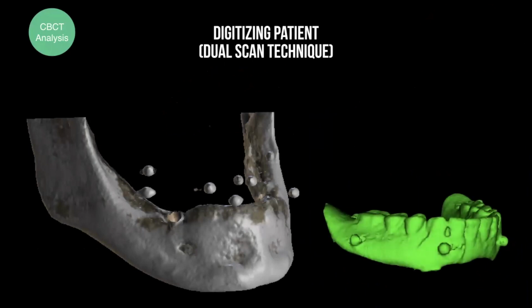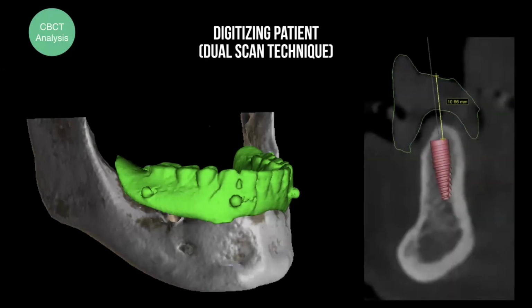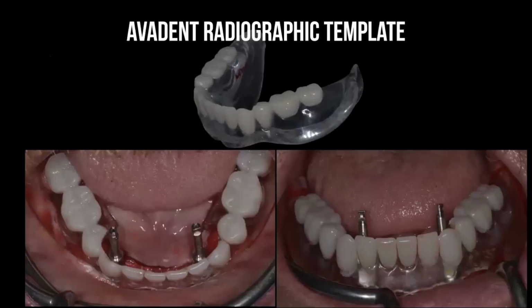And you know that there are a lot of companies outside, and they do the digital scanning for you. If you give them those files, they can even superimpose them for you. They send you the preview, and they plan it. So you don't have to be a computer genius about that. You just preview it, and if you like the location, you can make your surgical guide. And this is how you can see the buttons above it.